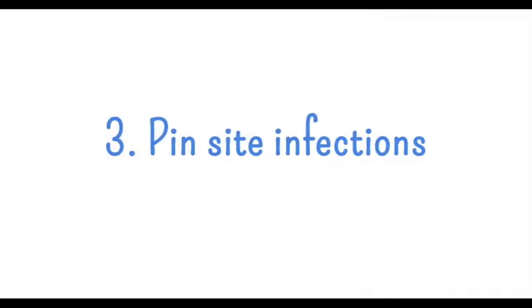The third one is the pin site infection. So you have to look for whether there are signs of infection surrounding the area. If there is a wound, you can ask to inspect and examine the wound.